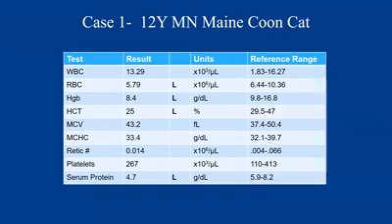If the anemia is non-regenerative, then there's a bunch of other differentials that we think about, like chronic illness, neoplasia, infection in the bone marrow, immune-mediated destruction, things like that. But again, the specifics are not the focus here, so we're not going to spend a lot of time on that. This anemia does look mild, and it's non-regenerative. I would suspect that this anemia is an anemia of inflammation or an anemia of chronic disease related to the diabetes. Our platelet count is within reference interval, and we have a little bit of a decrease in our serum plasma protein, but I don't have a chemistry to know which fractions are low.